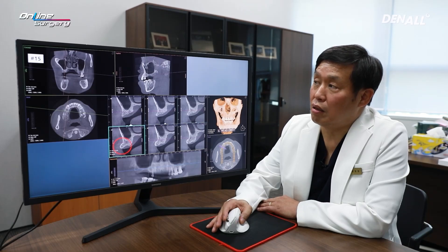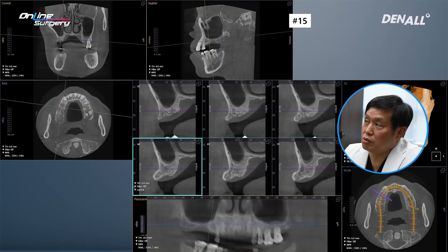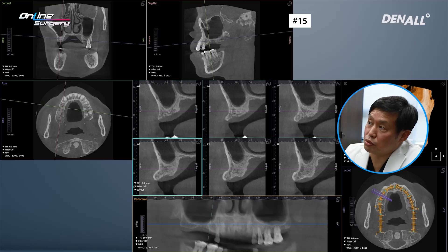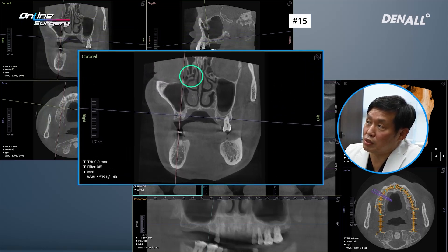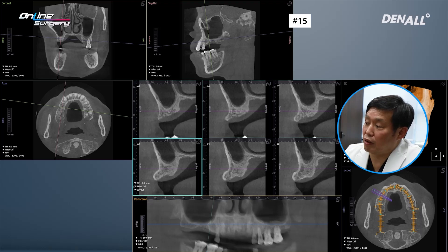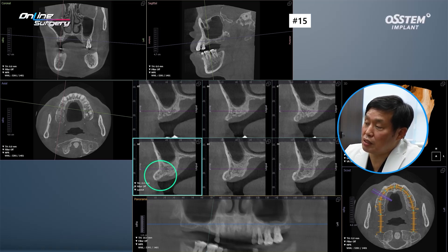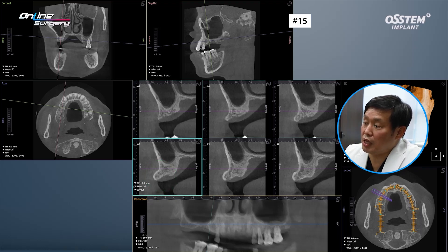This is the CT image before surgery at initial visit. The sinus patency of the ostium is well maintained and the sinus looks nice. The problem is number 15 — the alveolar bone height is about 10 mm. It's not a problem on the buccal side. There is exostosis, meaning there is a bone sticking out, which will be a problem in the prosthodontic phase.